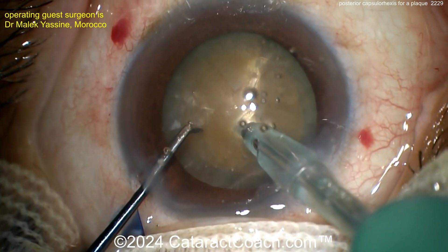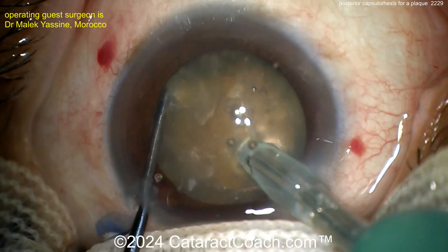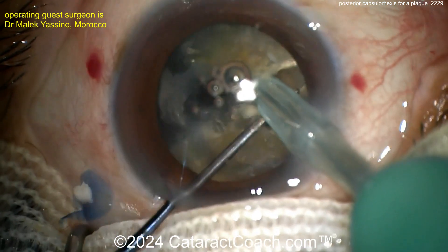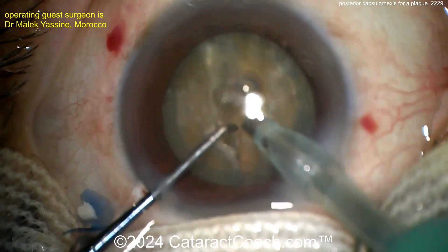A good amount of nuclear density. Burying the FACO tip nice and deep, like a submarine chop that Mohanta taught us. Chop, chop, chop — get that chopper across, nicely split, nicely done. I like the propagation of the chop throughout the piece.